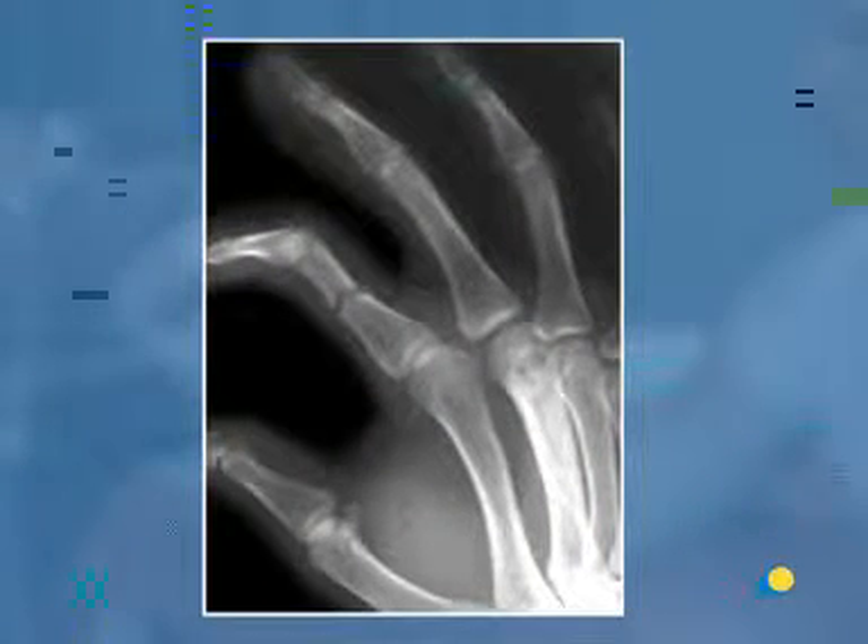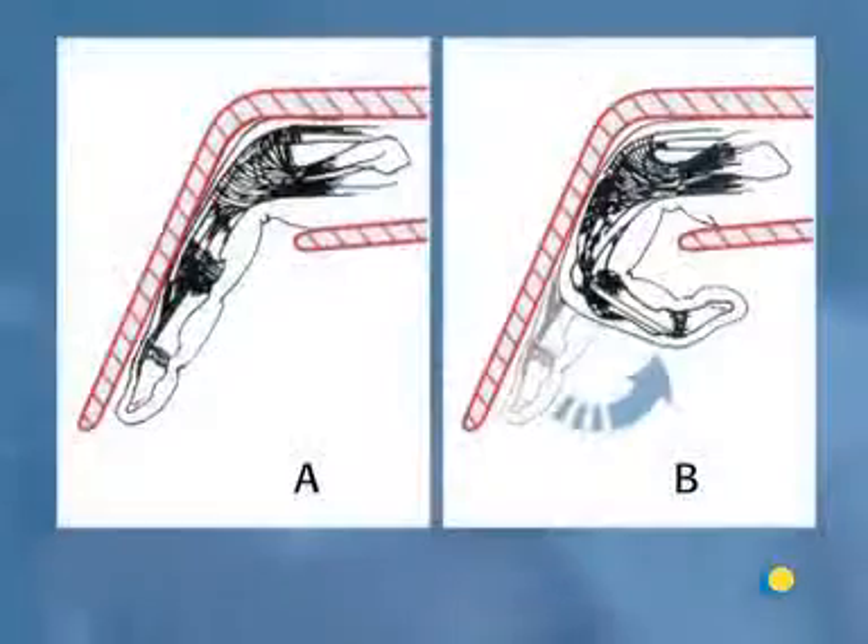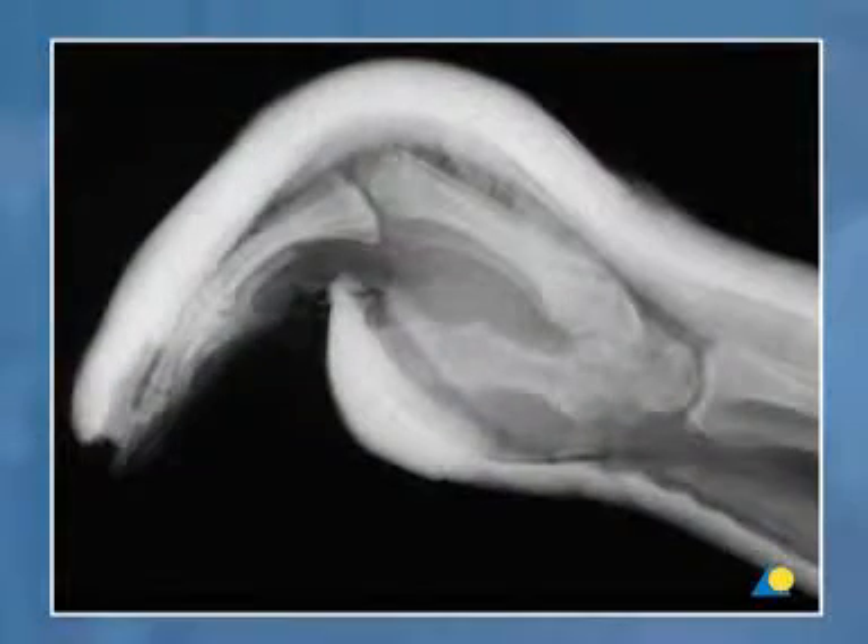Fractures of the proximal phalanx of the index finger are shown, again with volar angulation. This is the way an extension block splint should be applied to allow early mobilization of the fingers. This is a well-applied extension block splint.